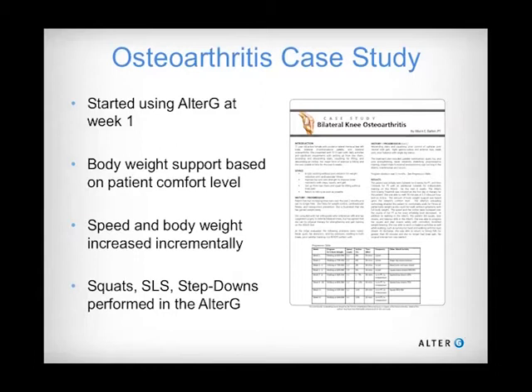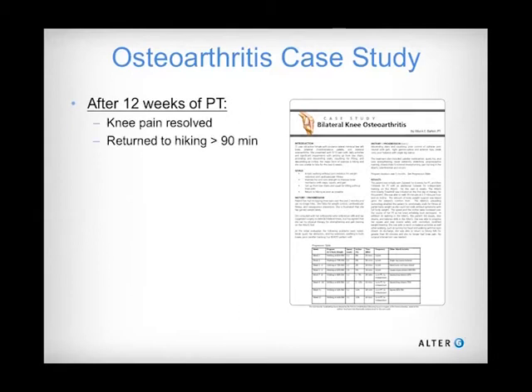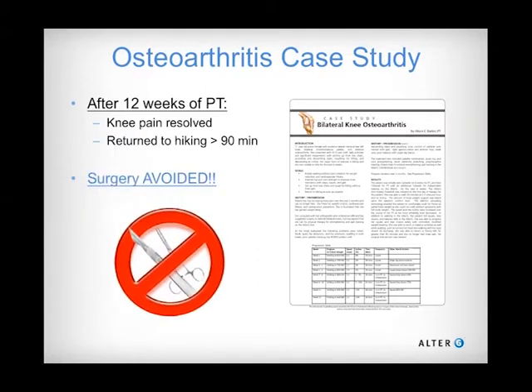She also did some squats, some single leg stands, some step downs in the AlterG. Again, loading properly, but not overloading or underloading. And after 12 weeks of PT, the knee pain resolved. Not any pain after that. She was able to return to her hiking, about 90-minute hikes, so she was thrilled. And most importantly, surgery was avoided.